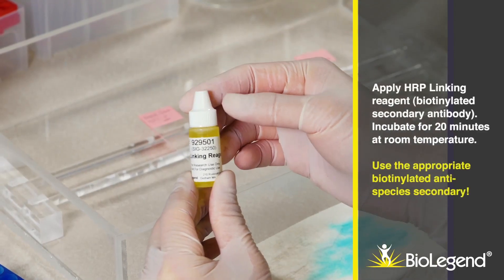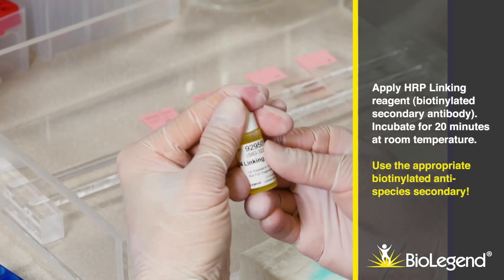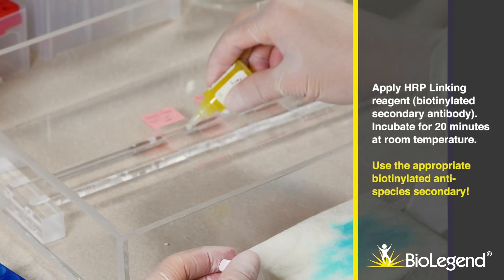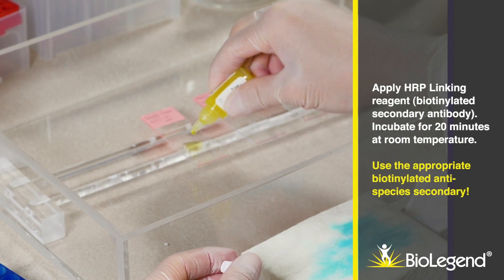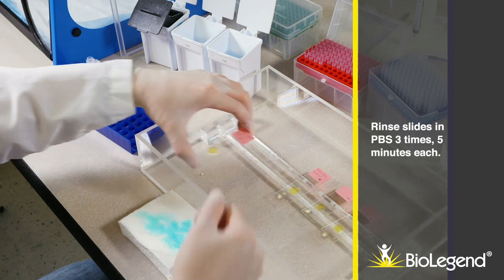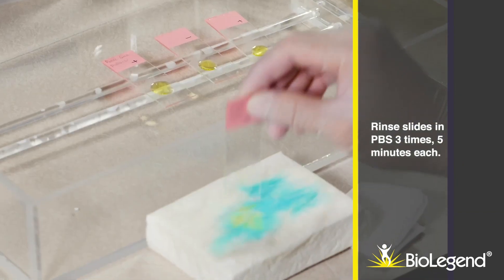Apply HRP linking reagent, the biotinylated secondary antibody. Incubate for 20 minutes at room temperature. Use the appropriate biotinylated anti-species secondary antibody. Rinse slides in PBS three times, five minutes each.